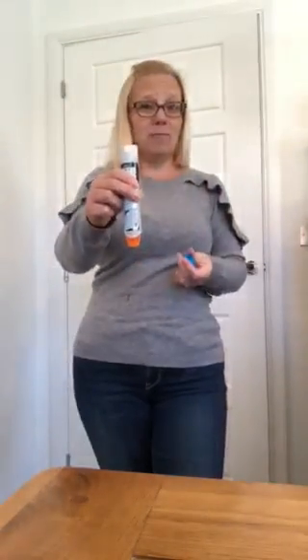Real pens come in a little container — you flip the lid and it pops out. On a real pen it will provide information on how to administer it. To do so, you take out the cap — it's now live and ready to go. This end is the needle, not this end, so keep it pointing the right way.